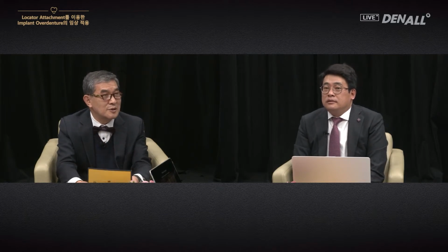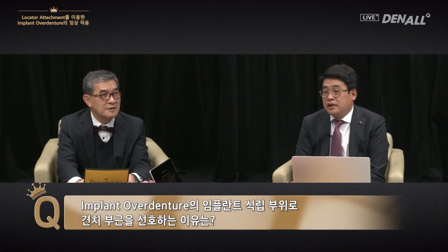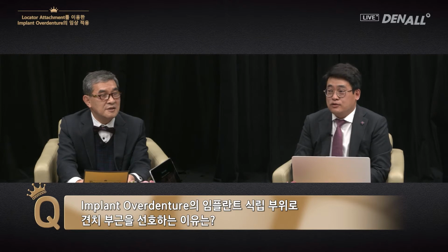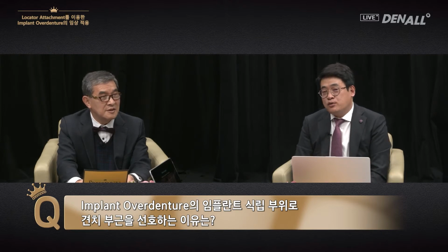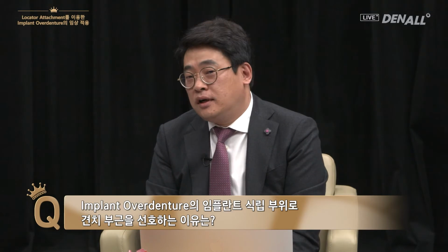In the canine area, is there a reason why dentists prefer this area? As you all know, canine has a very long root and it lasts long within the oral cavity, and therefore there's more alveolar bone. And there are many reasons why it's a good area for implant placement.